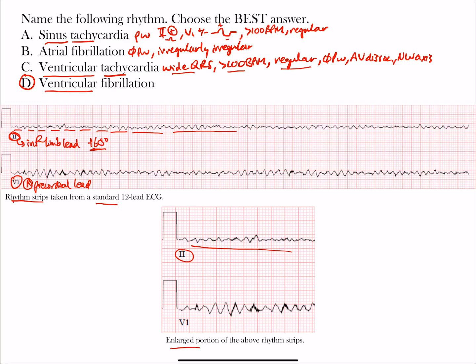V-tach is wide and fast with a regular rhythm — those are the main distinguishing features. Here in ventricular fibrillation you don't see a regular rhythm; there are no clear intervals to measure, so ventricular tachycardia is not correct. Atrial fibrillation is also not correct — with A-fib you may see fibrillatory waves but you still see QRS complexes with none of the R-R intervals being the same, which is why it's irregularly irregular. But you do have recognizable complexes in A-fib, whereas here you have no complexes at all.